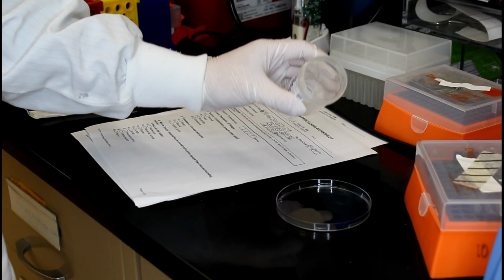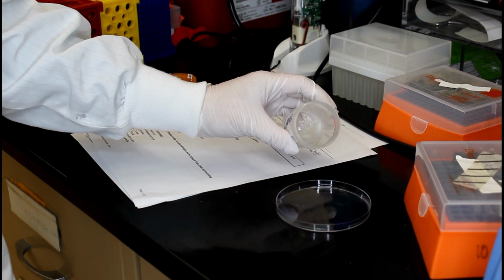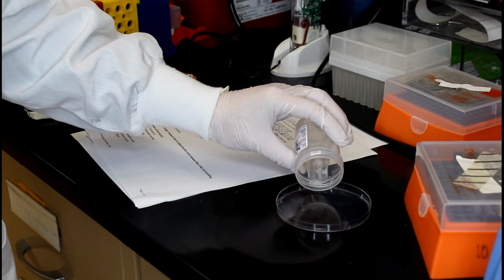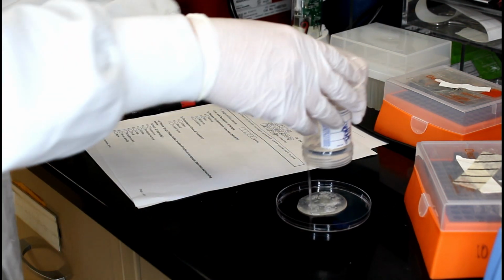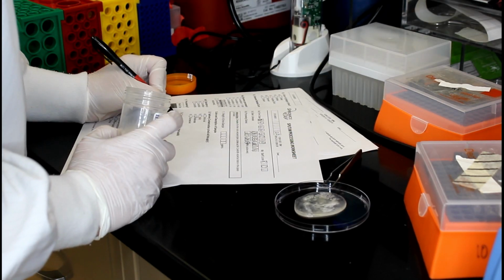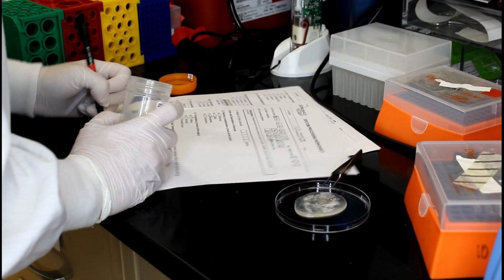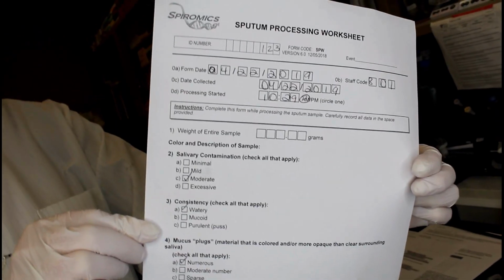The first step on your processing worksheet is 7.1.1, weighing the sputum sample. First, pour the entire sample into a petri dish and begin to record its characteristics, such as color, consistency, the presence of saliva, the presence of plug material.